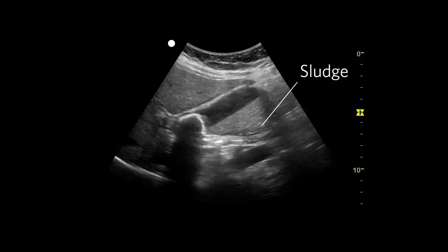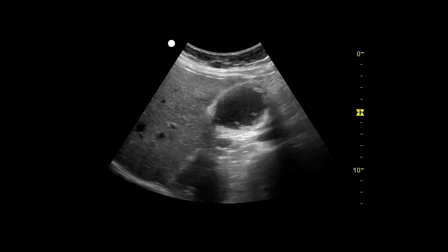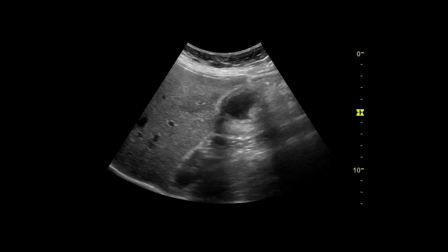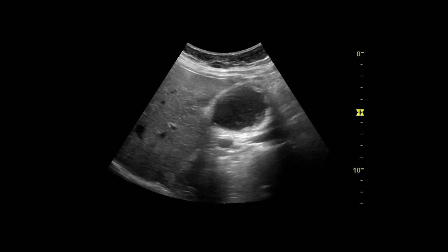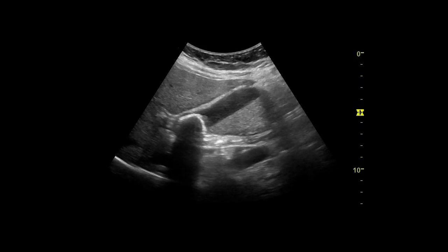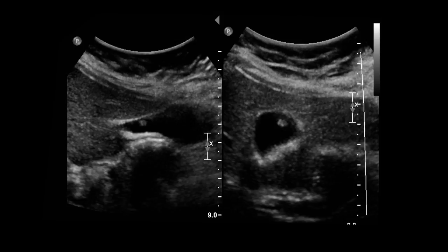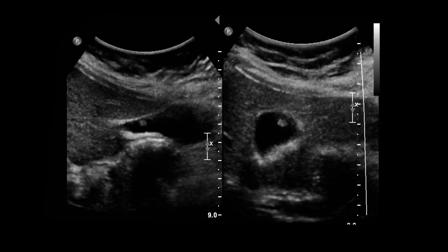Sludge in the gallbladder can be mistaken for stones, but more commonly, artifact can look like sludge. Artifact will disappear with probe movement and sludge will not. When imaging gallstones, watch out for polyps in the gallbladder. They may look like stones, but a careful assessment will show that usually the shadows aren't as dark and they aren't mobile.